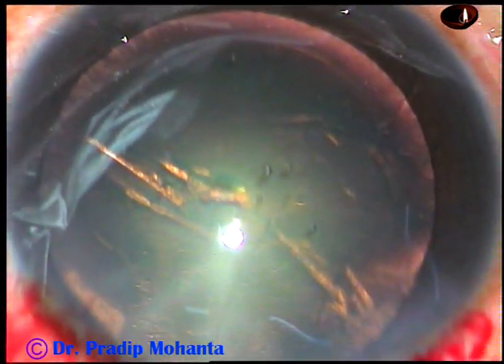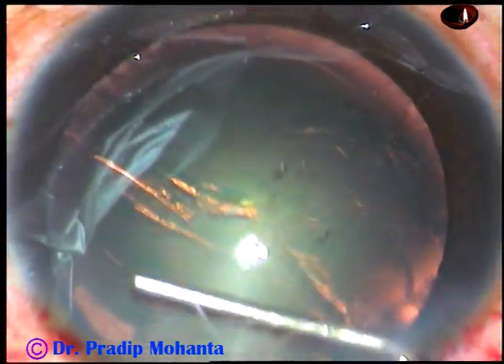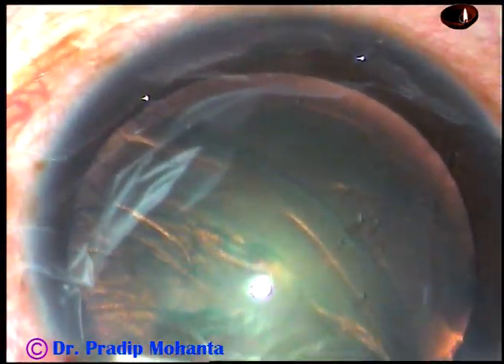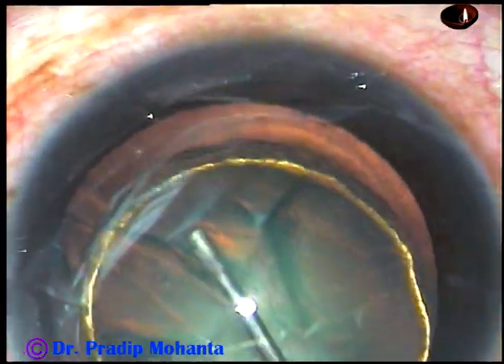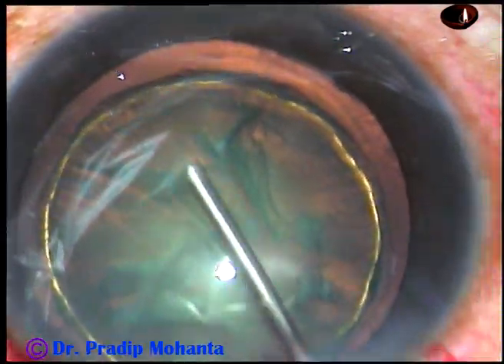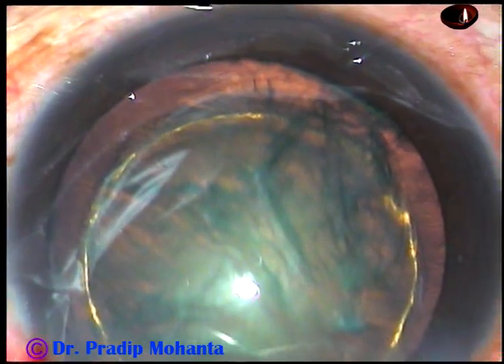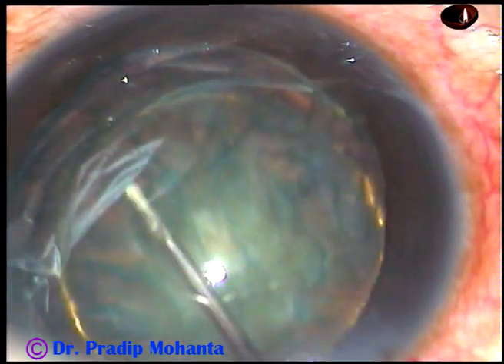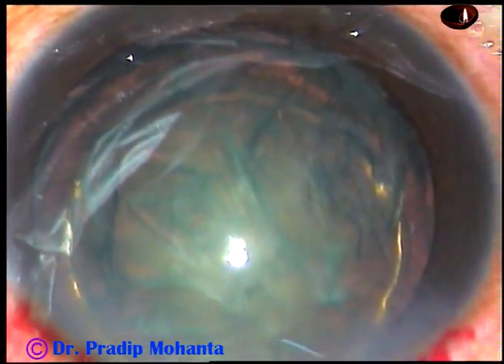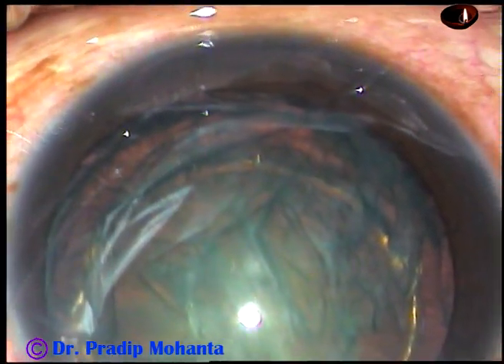And now hydrodissection is to be done. A 27-gauge cannula and balanced salt solution is being used for hydrodissection. It is done. And now hydrodelineation. For the carousel technique, it is a good idea to do a nice hydrodelineation so that we can place the phaco needle at the edge of the nucleus. This hydrodelineation has demarcated the nucleus and the epinucleus.